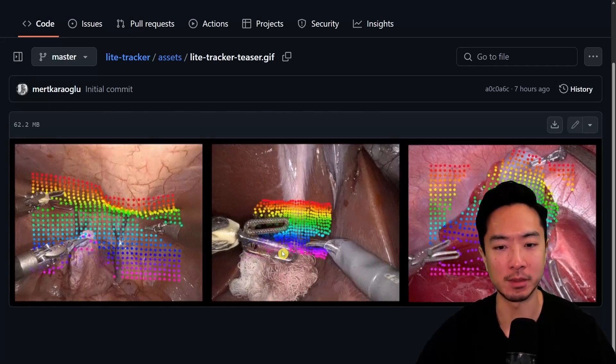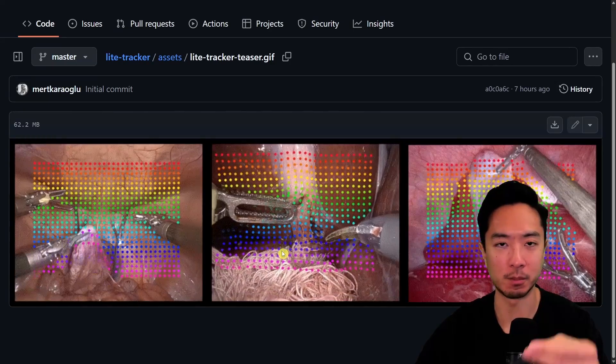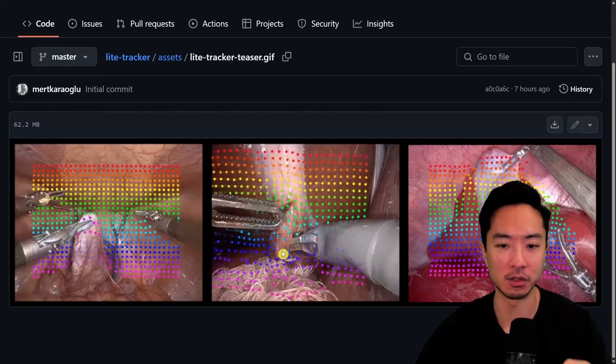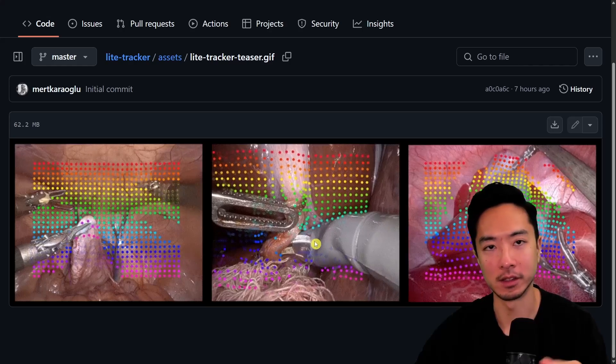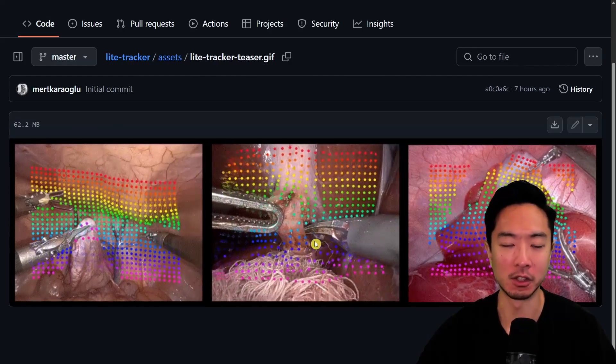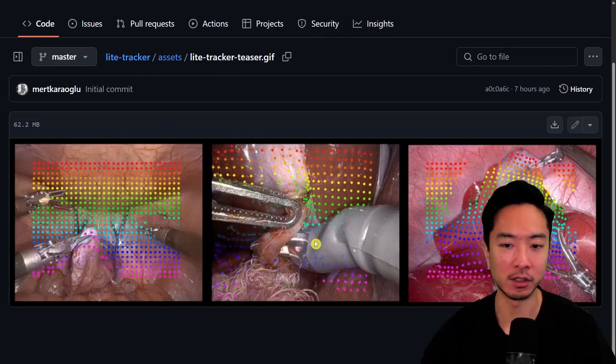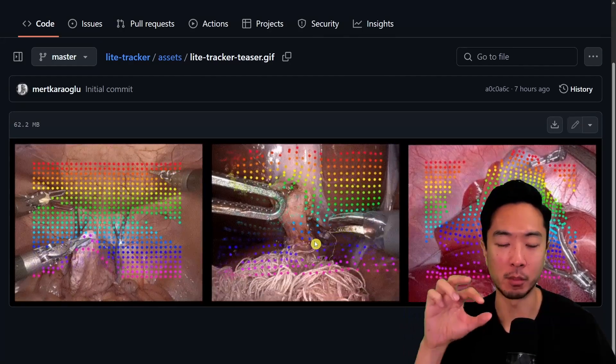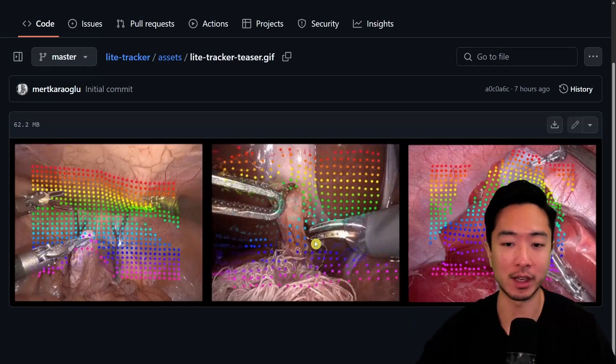What happens is when you have a user pulling on the tissue, you can see in the middle here the tissue is moving. Even though it's moving around, all the points on the tissue are being tracked.